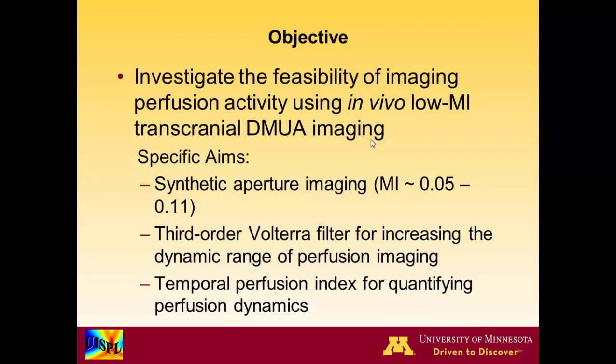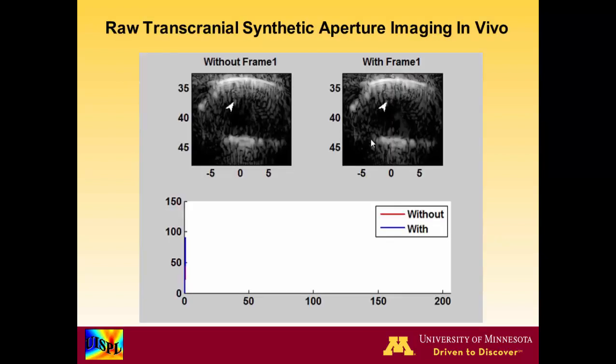Then we use the third-order Volterra filter to capture the nonlinear signal and increase the dynamic range for the perfusion imaging. And following that, we use the temporal perfusion index to quantify the perfusion dynamics, which I will talk about more later.